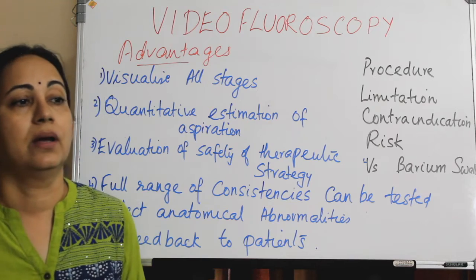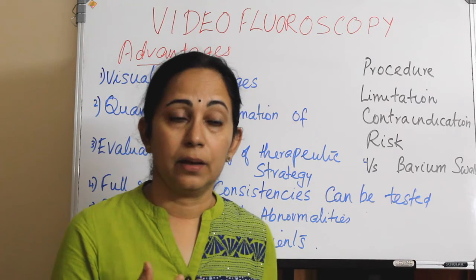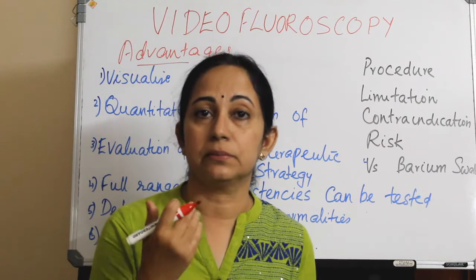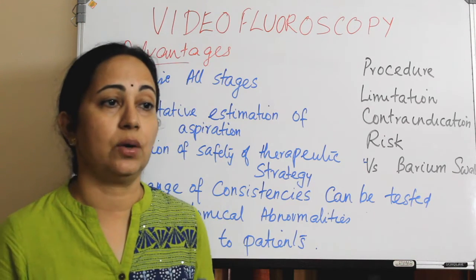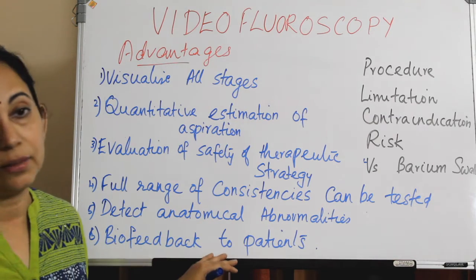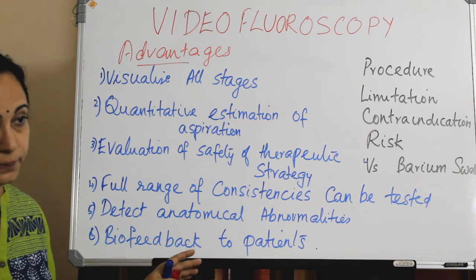The patient himself can assess the improvement or the response to treatment, especially while doing some therapeutic maneuvers to improve dysphagia or the swallowing function, by seeing the video of the videofluoroscopy. So these are the advantages.